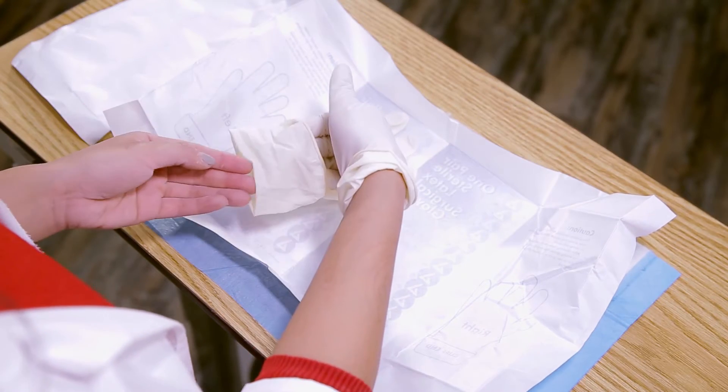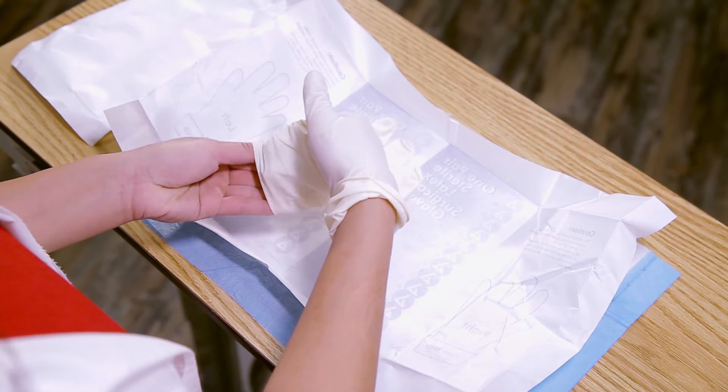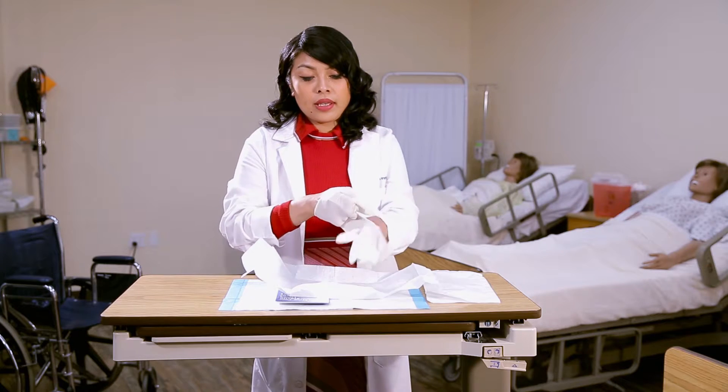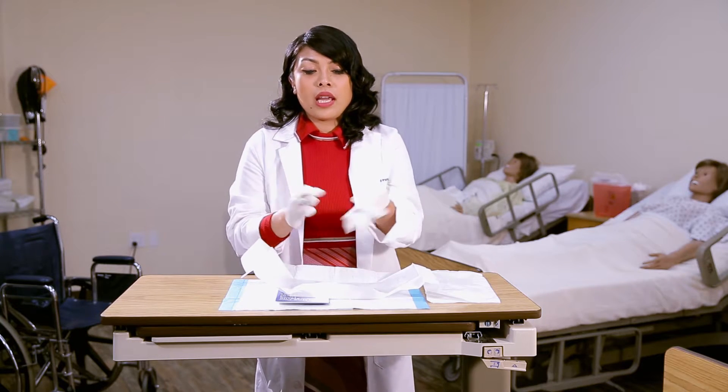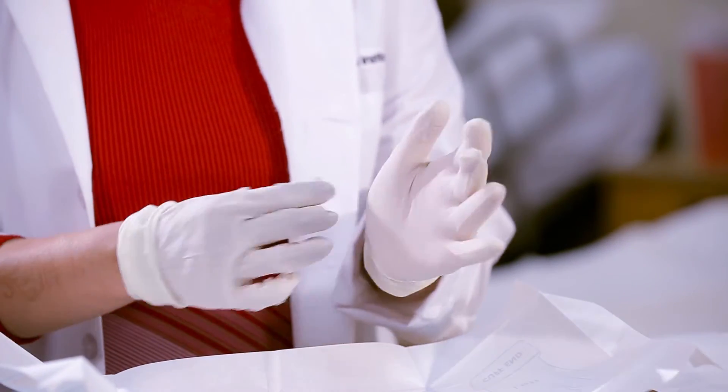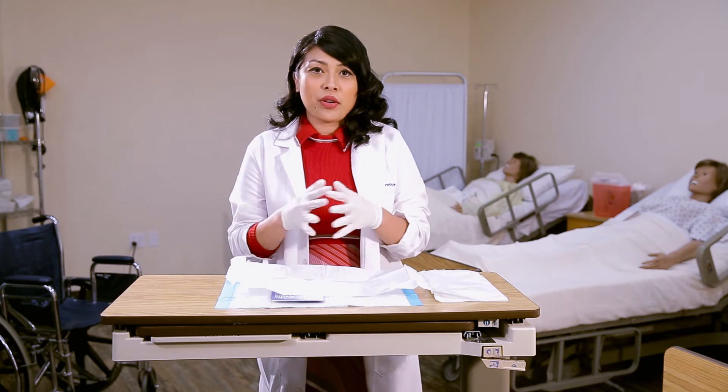From there, go ahead and under-cuff and insert the non-dominant hand. Pull towards yourself and then fix from there. Now that both sterile gloves are on, make sure the only thing you touch is within the sterile field — anything else will be contaminated.